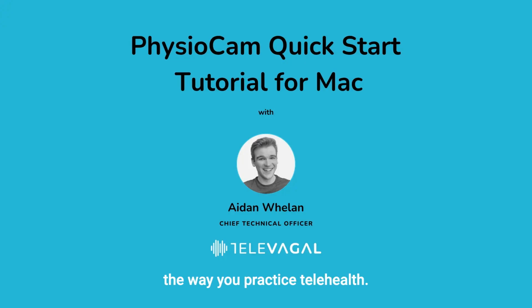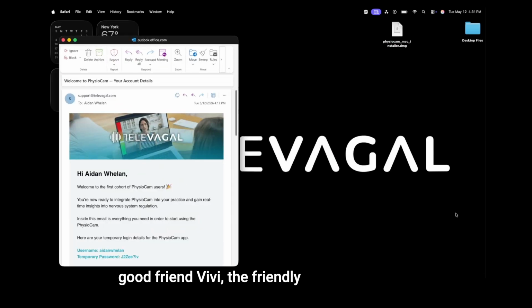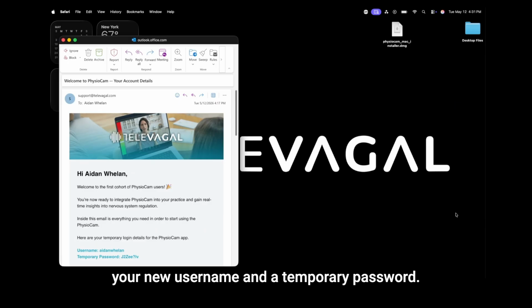you practice telehealth. To begin, if you've recently purchased a PhysioCam subscription, or if you've been invited by a clinician, you'll have received an email from our good friend Vivi, the friendly Televagal helper. Along with some helpful information for getting started, this welcome email includes a link for downloading the PhysioCam installer, as well as your new username and a temporary password.